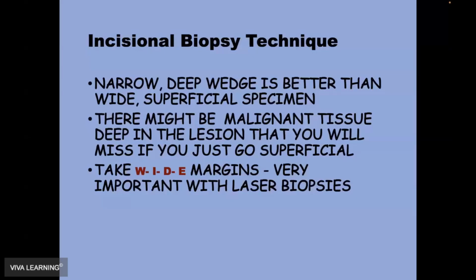And take wide margins. And this I'm going to discuss again a little bit later on, especially if you're using a laser, radiosurgery, electrosurgery, or anything aside from cold steel, anything that has the potential to char or affect the biopsy specimen. You don't take regular margins like you would with a scalpel.